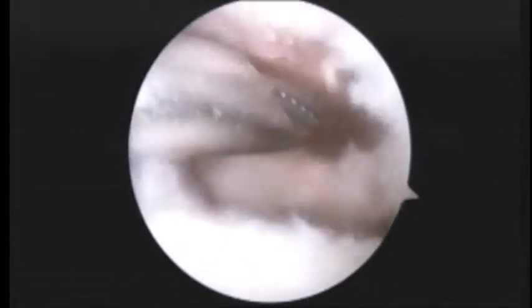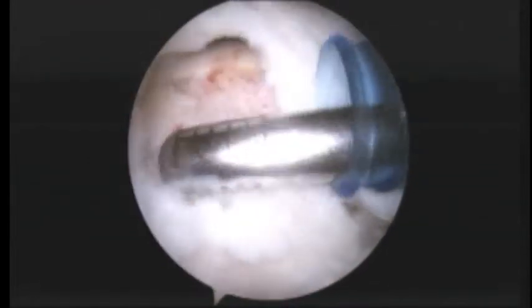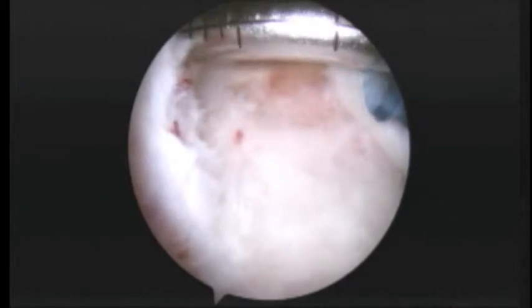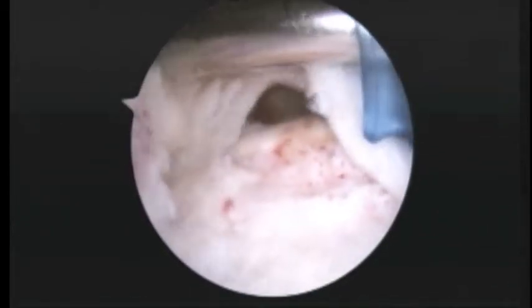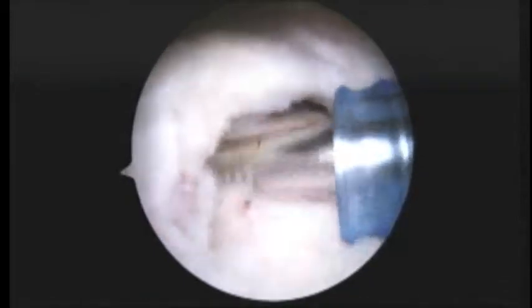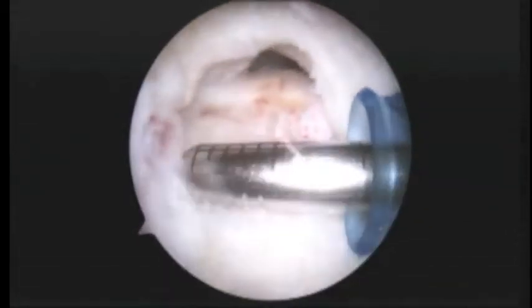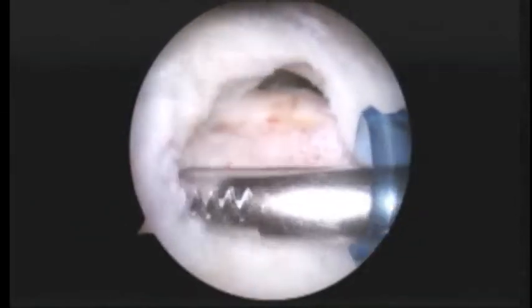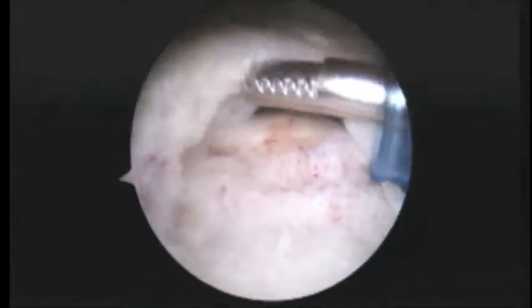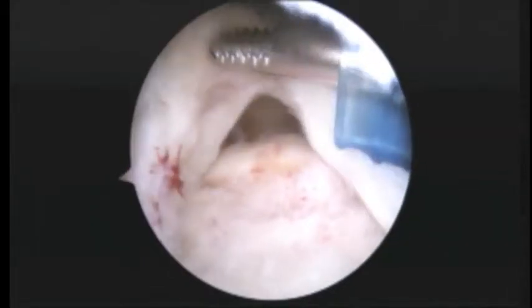Pause, please. So this is the tear in the tendon. Just been working to clean up the edges and identify the bone so we can get this repaired down. As we lift up here and look to the left, which is posterior, we can see the tear extending down this way. Up, we can see how it extends back there.